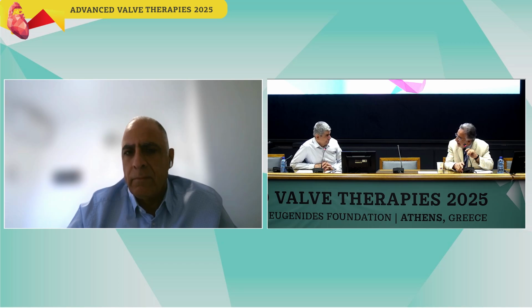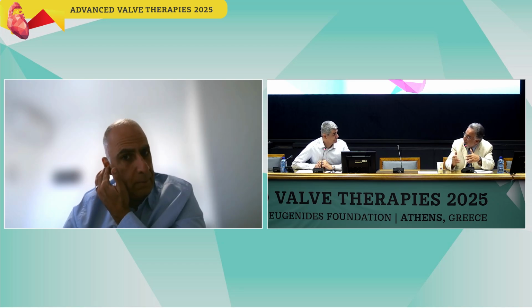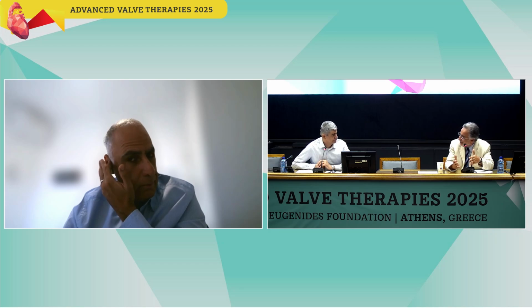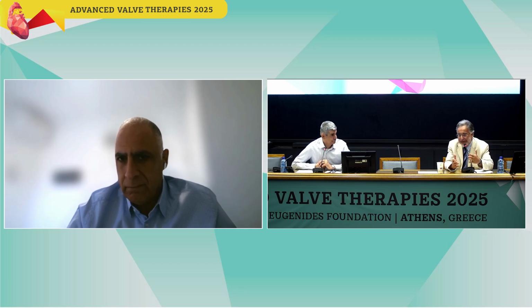And at the end of the day, we should be aware that we need the pressures of the LA for the final judgment, especially in functional MR, because, and I'm sure that you have this experience, quite often with the anesthesia, during the intervention and before the final outcome, the amount of color is misleading. So we have to be aware of the pressures themselves in the LA.